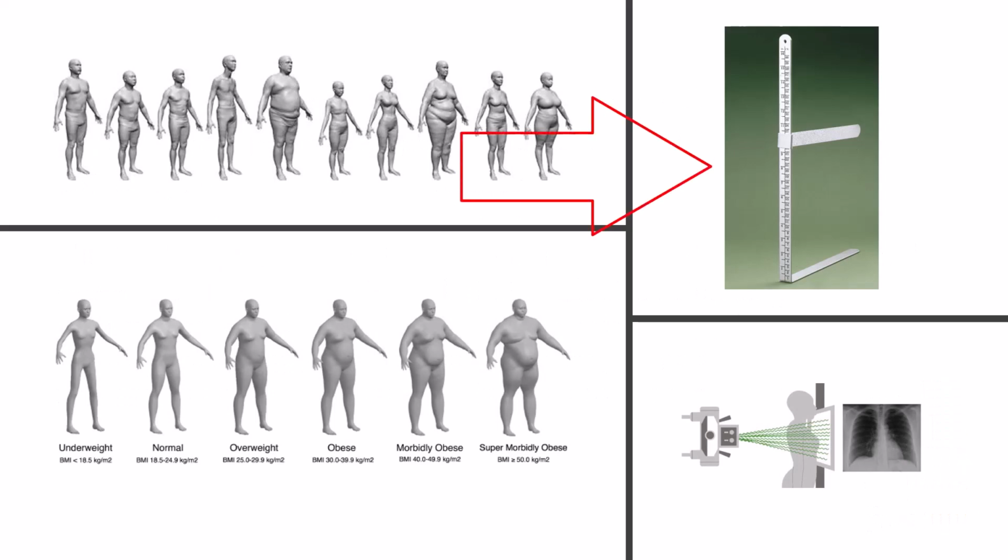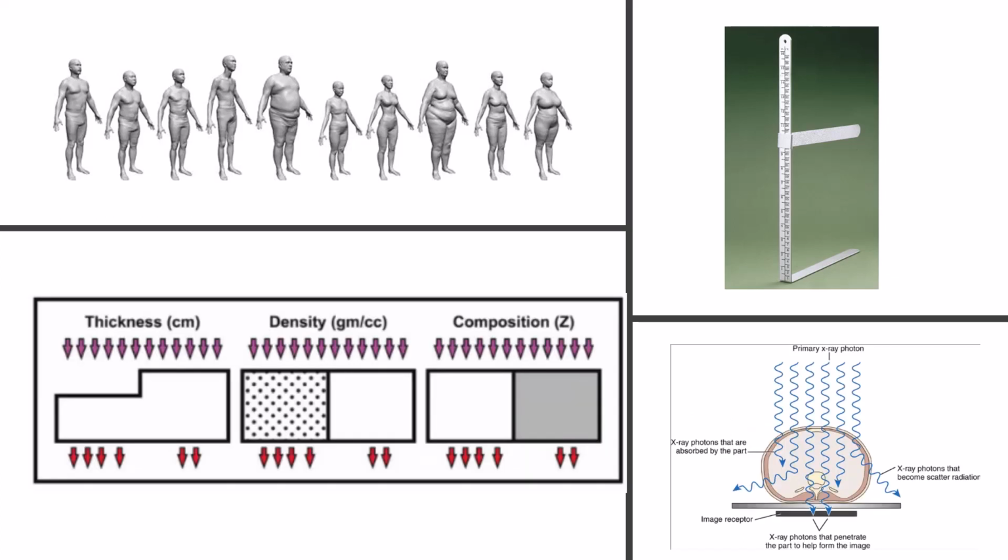The thing that hangs on the wall that nobody uses is called a caliper, and it's to measure patients. I just joke that nobody uses it, but most people think they can eyeball it and figure out just how thick the patient is. Using the calipers, we can get a baseline measurement and then utilize our knowledge about tissue, such as adipose tissue or COPD, to change the techniques appropriately. In most cases, we won't have to change the technique because it will be adequate as it is for the average patient.